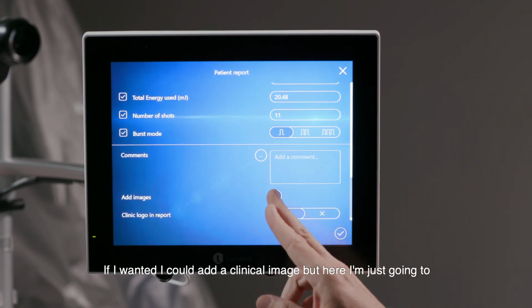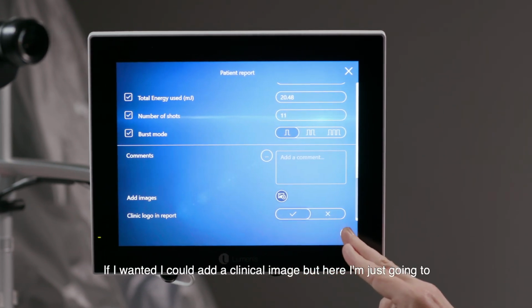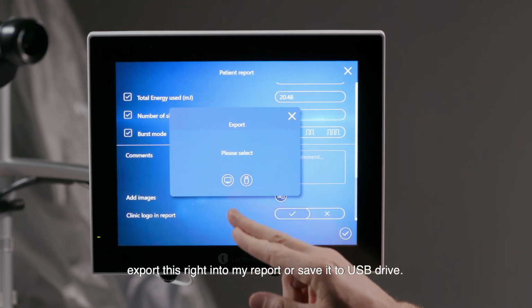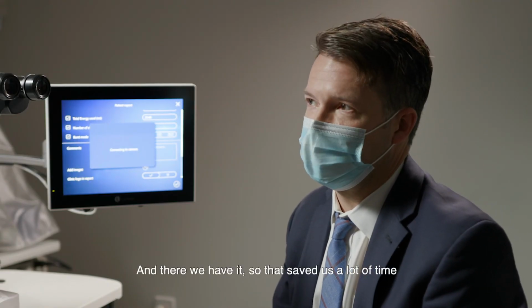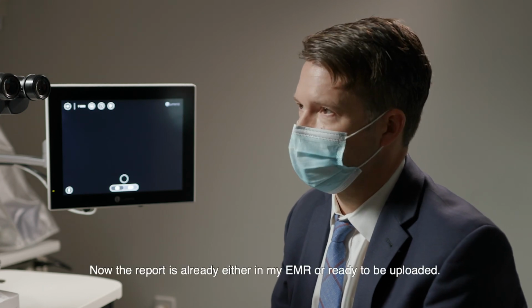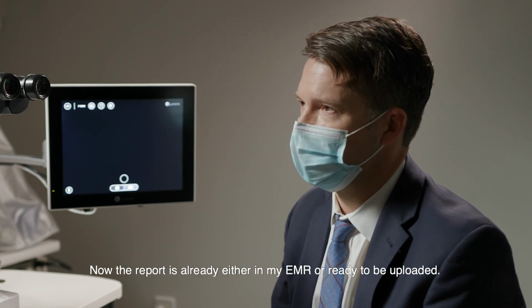If I wanted, I could add a clinical image, but here I'm just going to export this right into my report or save it to a USB drive. And there we have it. So that's saved us a lot of time in terms of inputting variables. Now the report is already either in my EMR or ready to be uploaded.